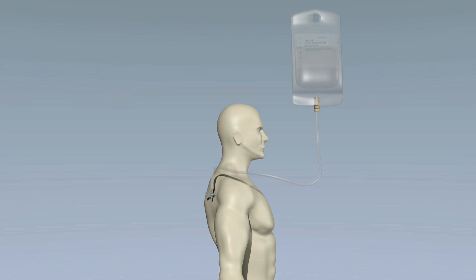It provides pressure within the joint which helps to control bleeding. If there is too much bleeding, it becomes impossible to see. It also helps to irrigate and wash out the shoulder.